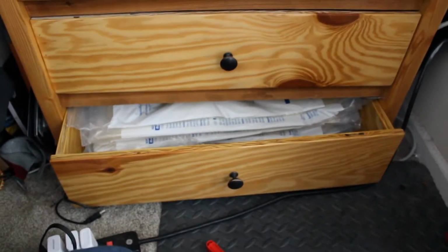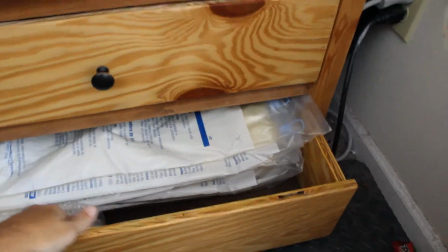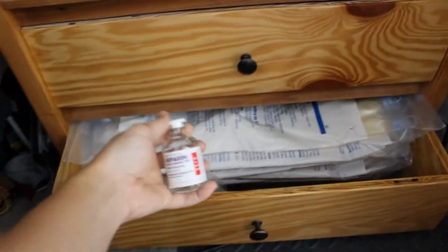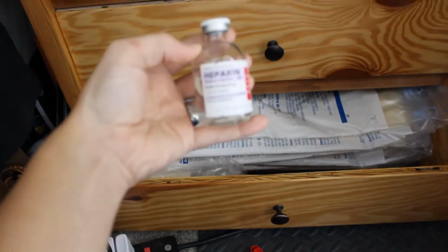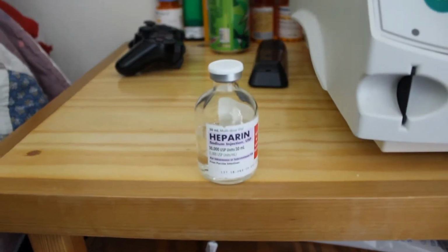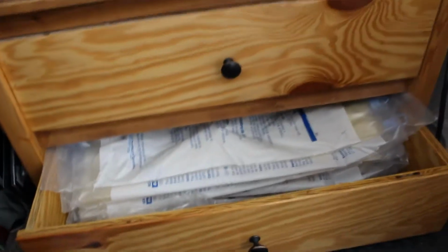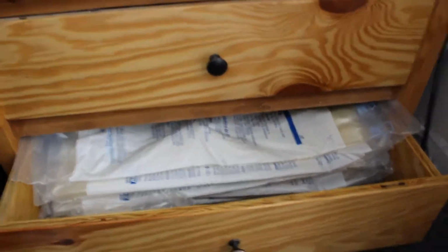Okay, so this is my dialysis table. This is the bottom drawer. I leave the drain bags in here, and I have my heparin in here as well. So you can see this is just regular heparin, which I have to use occasionally, about twice a week, with my dialysis setup in order to ensure that I don't have any blockages or anything like that. Pretty simple, not too bad.